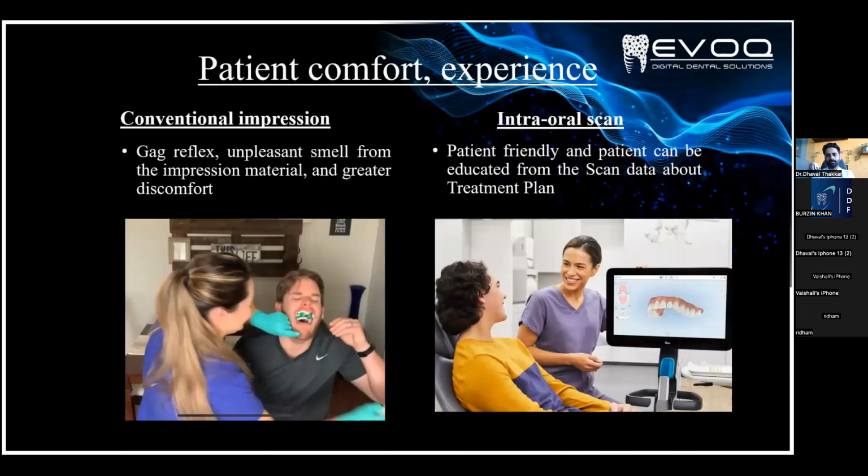First thing is patient compliance. Right now, patients are also very smart, they Google everything. They visit multiple clinics before final treatment execution. So patients also demand that their measurements be taken with 3D measurement software or any camera software. It's always a convincing point for the doctor, who can live show the patient what is there in the patient's mouth, what is happening in their mouth, what data is captured, and what treatment is going to be executed on the patient's database.